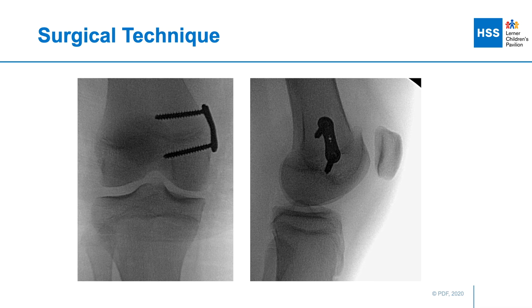This is what it looks like on final AP and lateral fluoroscopic views. On the lateral view, the plate is in line with the anatomic axis of the distal femur, and the tip of the epiphyseal screw is contained anterior to Blumensaat's line and posterior to the lateral projection of the deepest part of the trochlear sulcus.